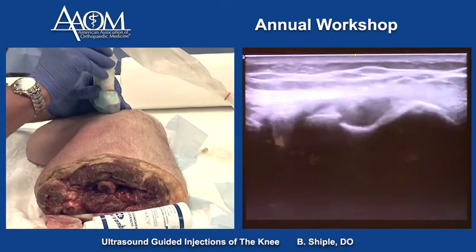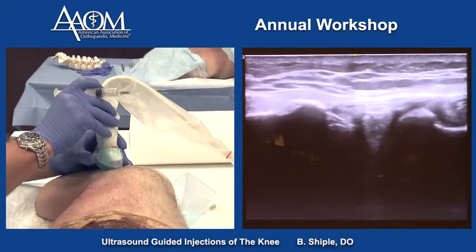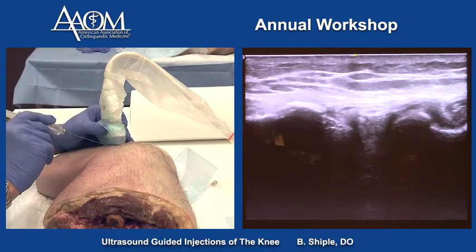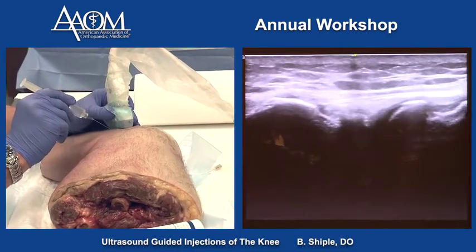We can also get into the lateral meniscus — specifically the body of the lateral meniscus. If you had a tear here, same short axis technique: one centimeter away, and the needle is in the meniscus right there.